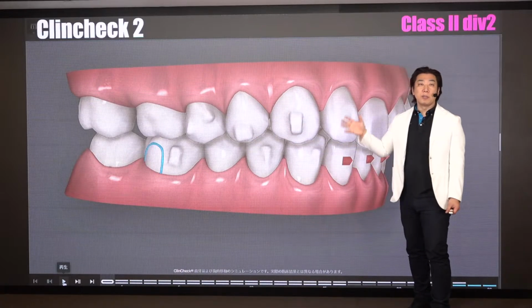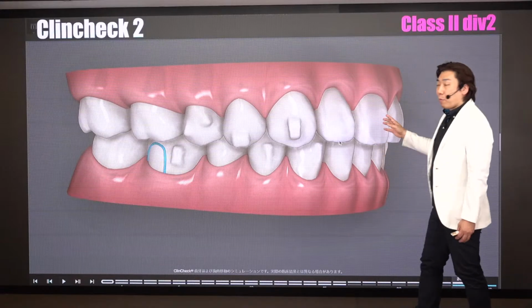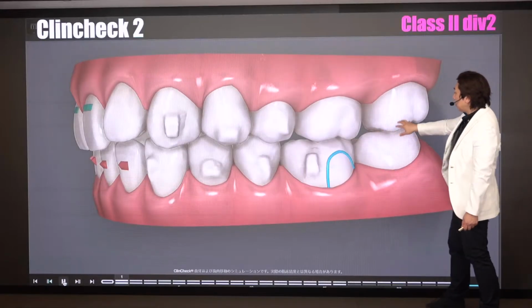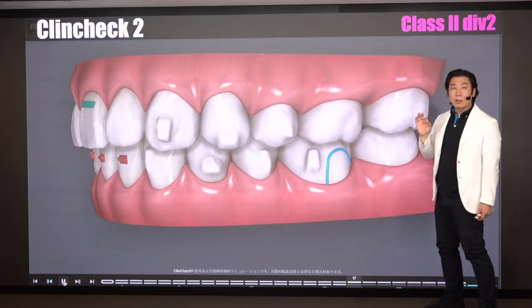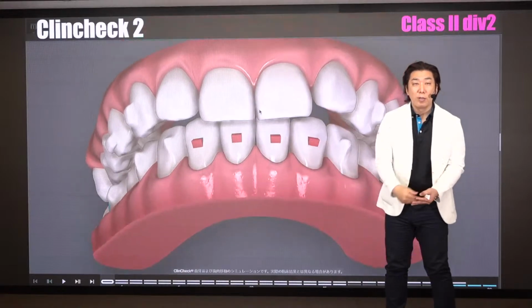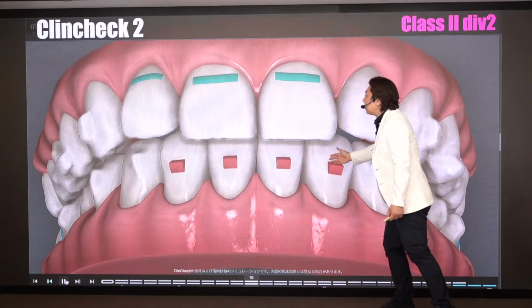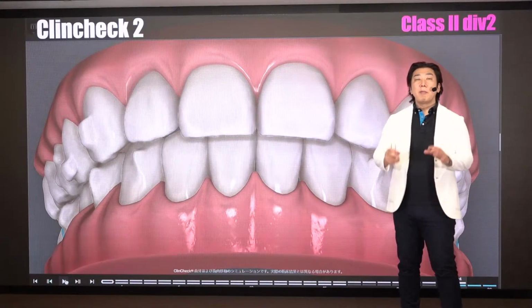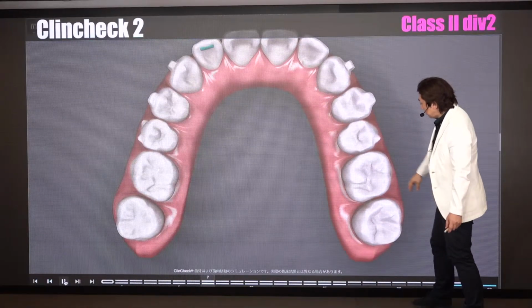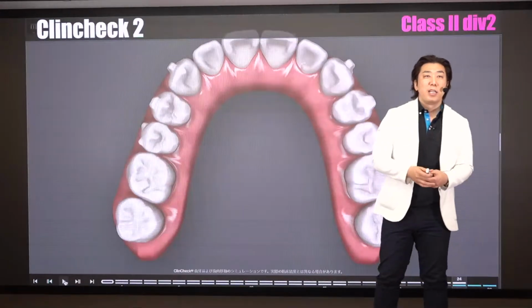This is the real upper molar distalization account. Because at the initial time the mandible was shifted to the back, but now it is already in a good position, then alignment. As you can see here, this is a refinement. Initially, just slightly distalize. Initially, definitely a class 2 canine and class 2 molar situation, but now different. Then we started treatment, extrusion and control of the anterior guide. Then all the teeth bite well, with good position and alignment of the upper arch here. If needed, just a little bit of additional distalization, but my planning in refinement is just a little bit of expansion of the upper and lower arch. Alignment here.